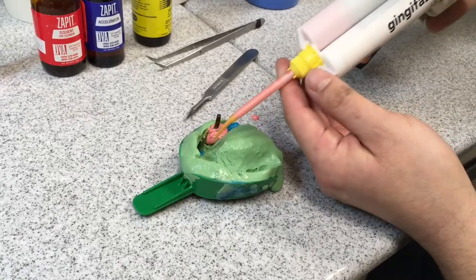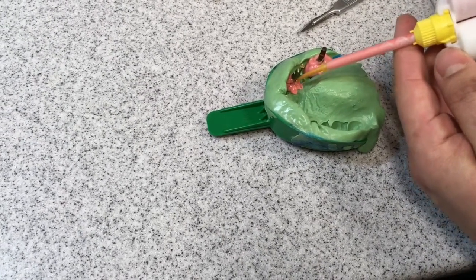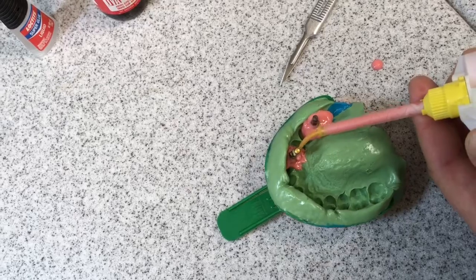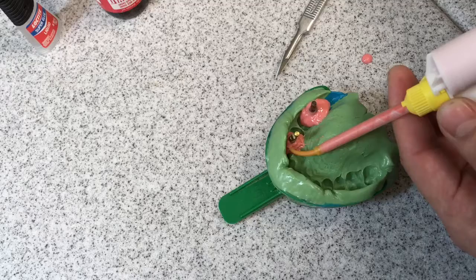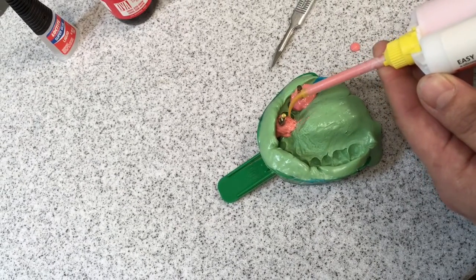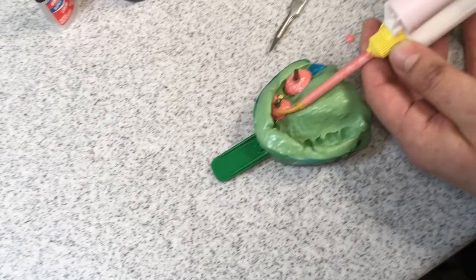We're trying to cover all the way up to the engaging portion where the two meet. If you don't incorporate that you're just gonna bury it in stone later, so pour a lot and incorporate it now. Get all the undercuts.